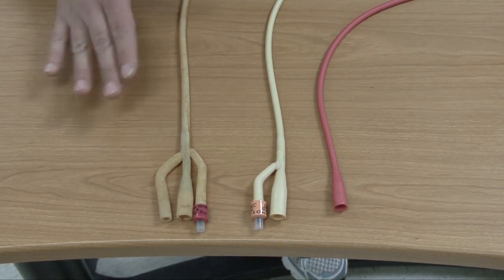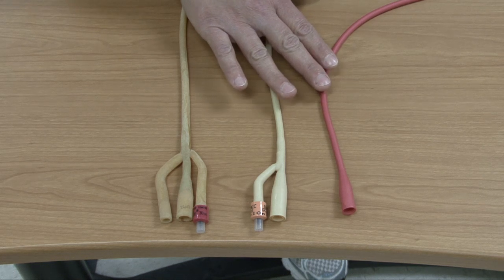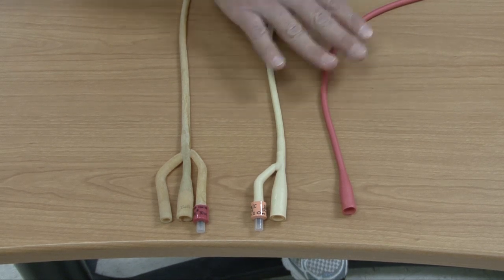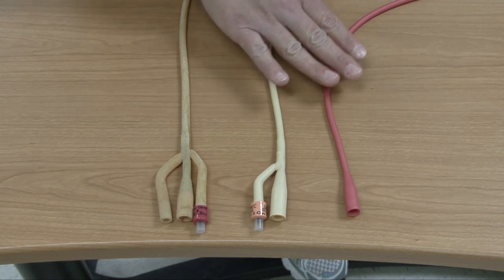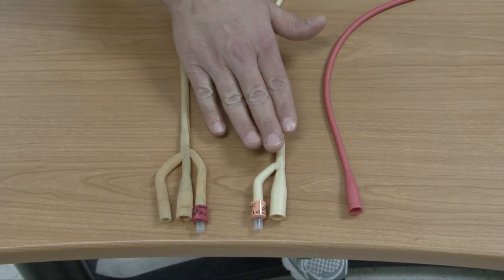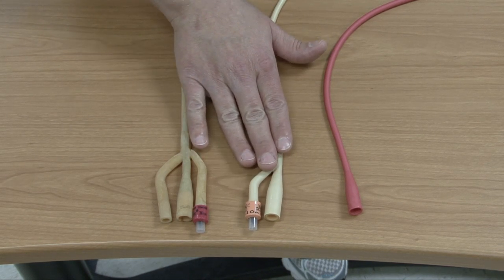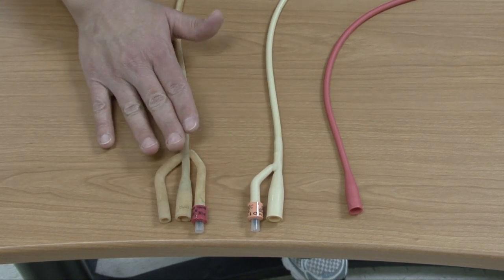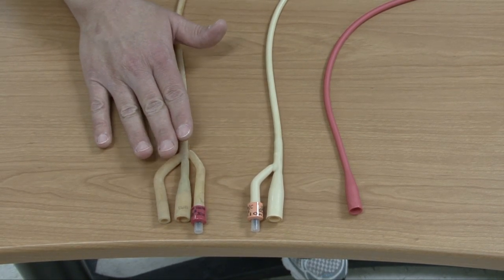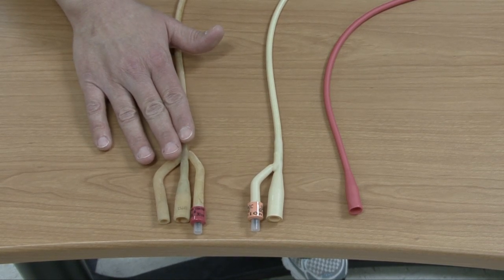This first catheter might be used for what we call an in-and-out specimen — going in just to see how much urine the patient has in their bladder for retention purposes, or to get a specimen. This second catheter would be more of what we call a retention catheter — it stays in the patient and allows for drainage of urine. The third one allows for drainage of urine but also irrigations. Always make sure you know the reason for the catheter.